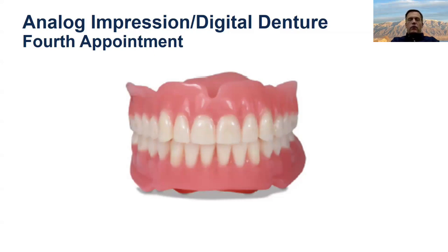The second workflow is using special carded teeth that are designed for digital dentures. So the intaglio surface of them is shaped kind of like an ovate pontic to fit nicely into the denture base. Or your laboratory can print the base and mill or print the teeth. I think that's the most popular option in 2024, both because there are some great printed materials for teeth finally, and because then if there isn't a lot of restorative space, it's not as big a problem.